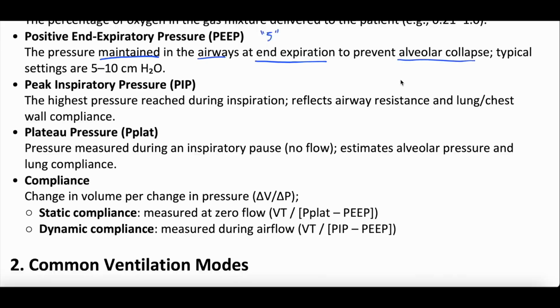All right, because if the PEEP went to 0, if there was no pressure and you let a patient fully exhale all of the air out of their lungs, well, whatever the exhalation volume is, we should say, and there's no pressure left, those alveoli would collapse. And then when you push a breath back in, those alveoli will be kind of ripped back open, and it can lead to something called atelectatrauma. Atelectasis being that collapse of the lungs, atelectatrauma being what can happen if you have too much alveolar collapse and reinflation, collapse, reinflation, collapse, reinflation.